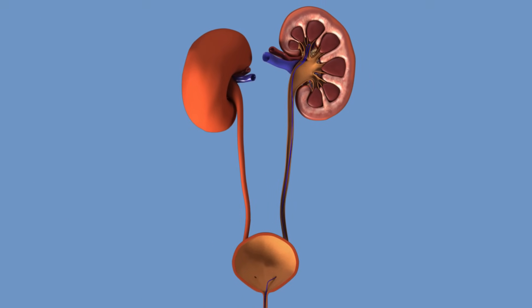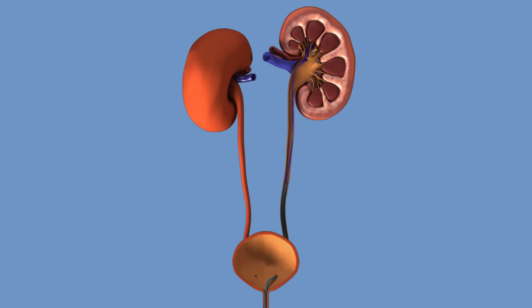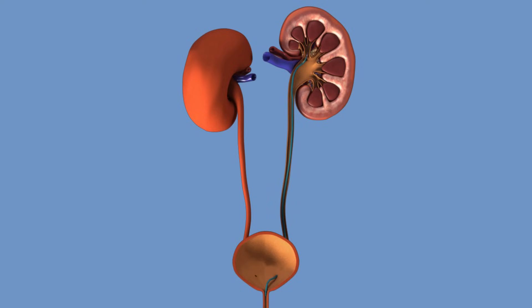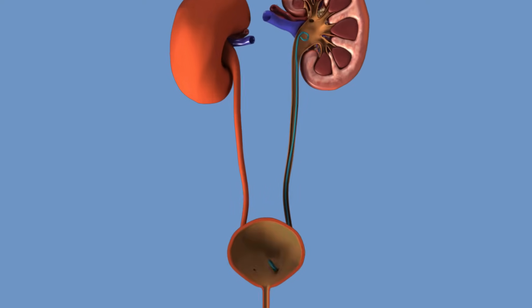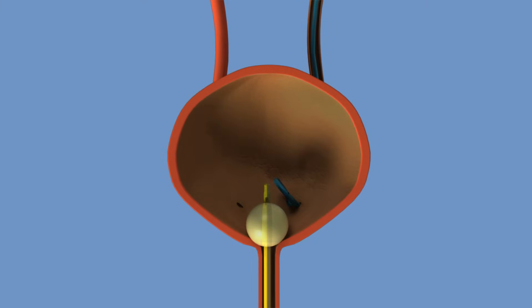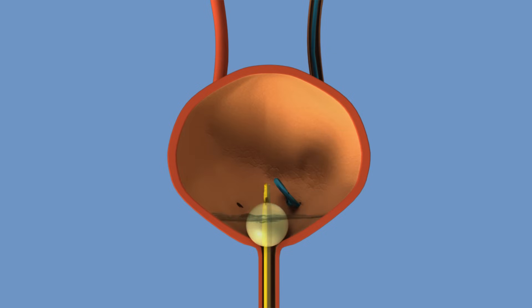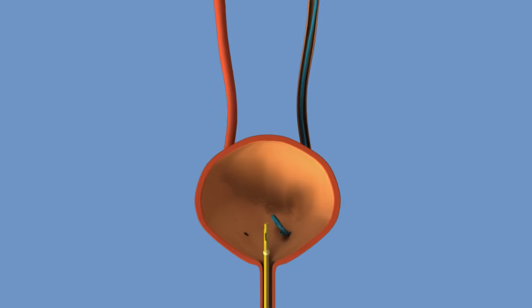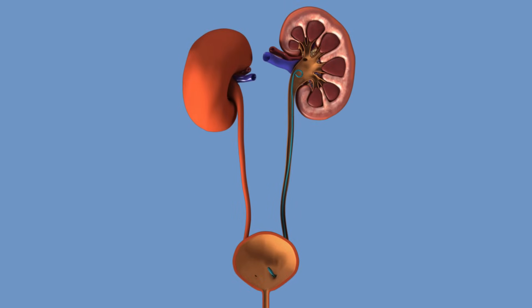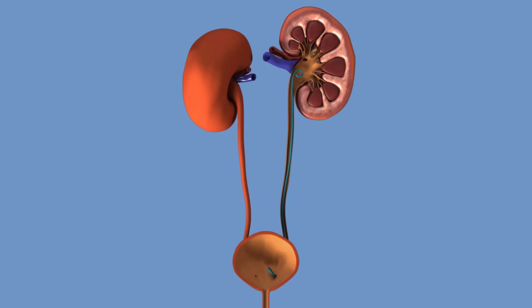Your doctor may place a temporary small tube called a stent within the ureter at the end of the procedure to ensure that swelling does not block the drainage of urine. A catheter, which is a tube placed through the urethra into the bladder, may also be used to drain the bladder. This catheter remains in place with the use of an inflated balloon. The catheter and stent are usually removed shortly after the procedure.